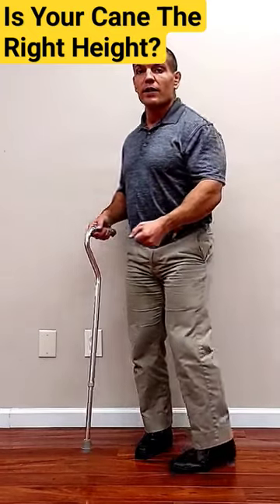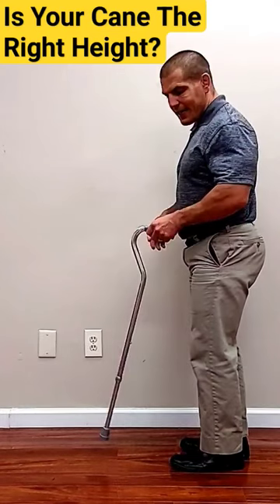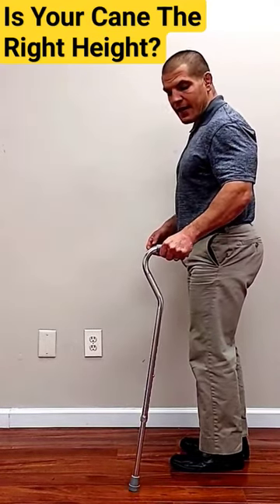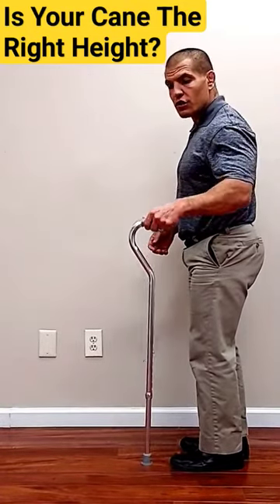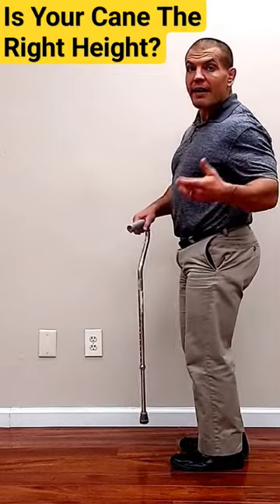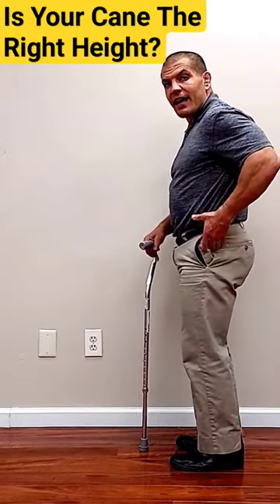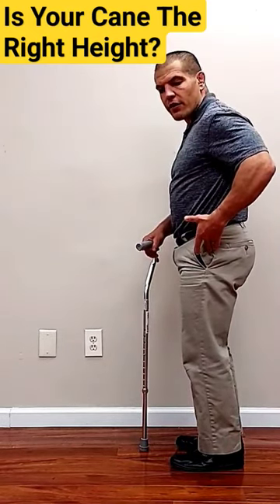When you are using a cane, ideally you want your elbow to be bent about 20 to 30 degrees when the cane is 6 inches in front of you and 6 inches out to the side. Another quick rule of thumb: for most people, it's around the height of your greater trochanter, or the bump on the outside of your hip.